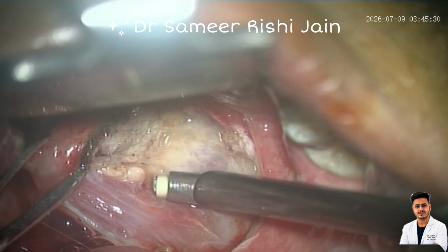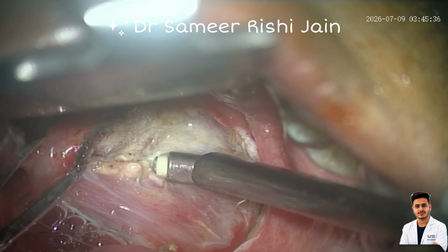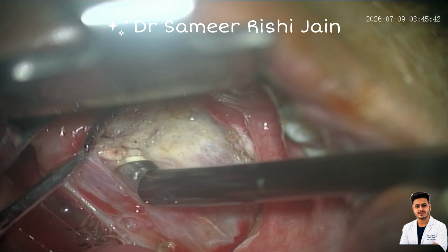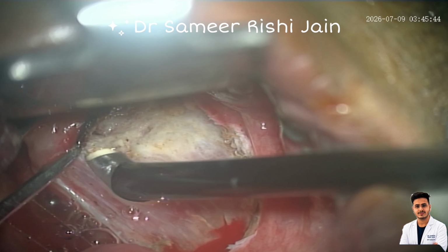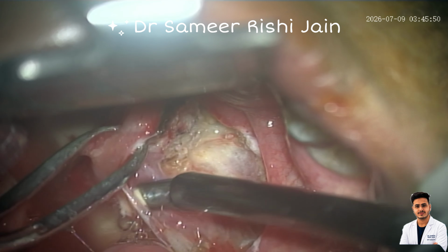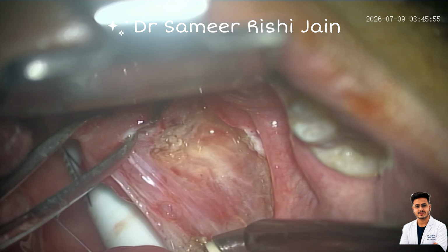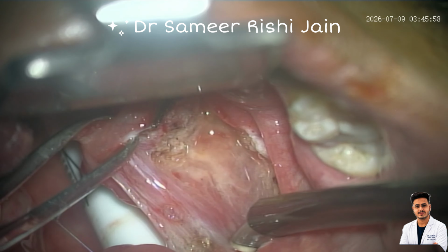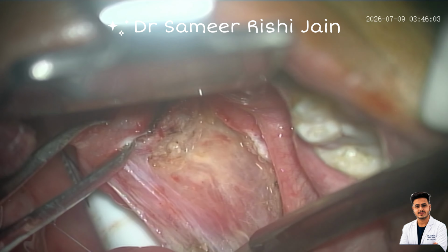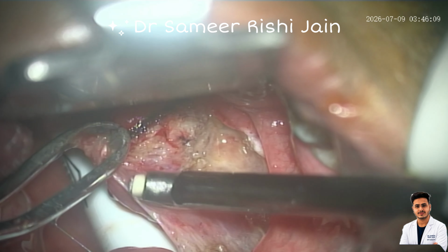The minor oozing or the bleeding can be controlled with the help of coagulation. We have to use the concept of traction and the counter traction. Generally, the infected tonsils are the ones which bleed and they are very vascular. We can use the coagulation mode wherever we feel there is a little bit of bleeding or the oozing.